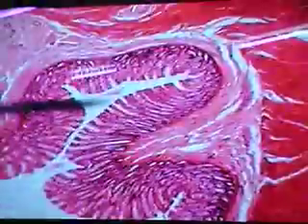That's still colon. Let's go back and see if we can find a bit of jejunum. Ileum, yeah. There we are in the land of ileum. Now, we are fortunate that we are seeing right here the Peyer's patch.